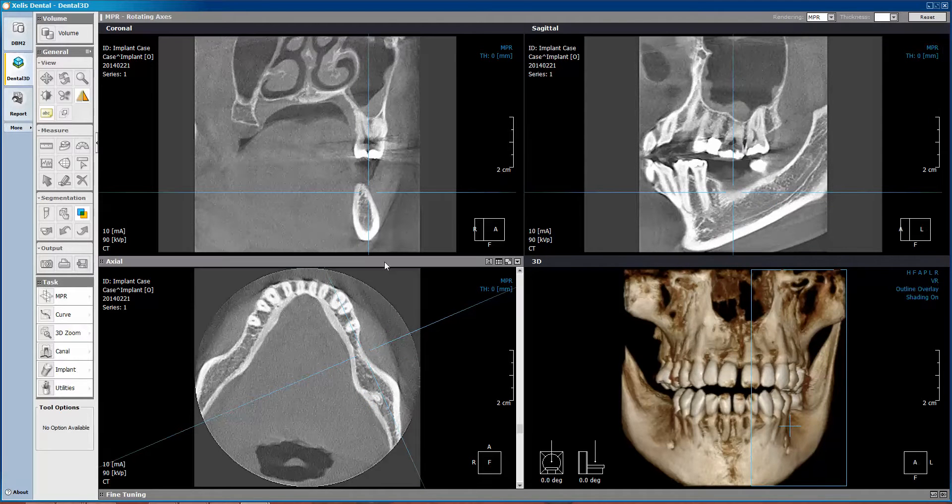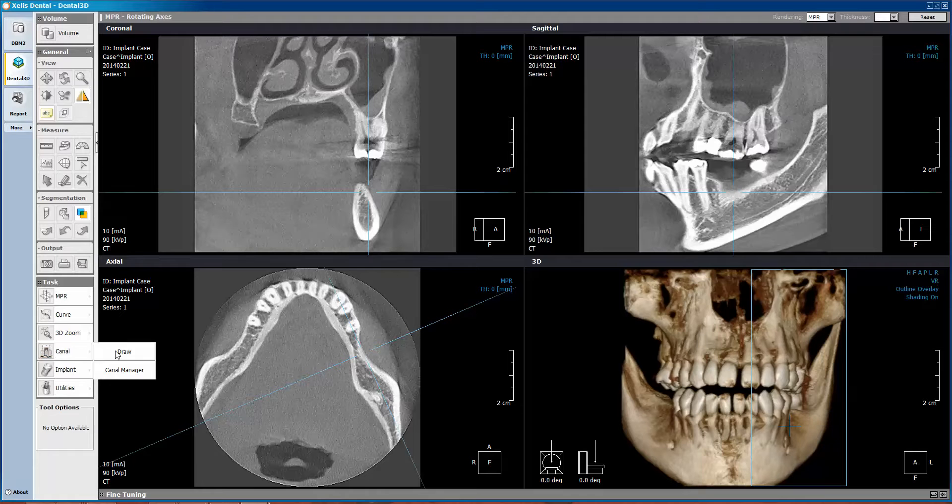We'll then move to the left of the screen. Within the Canal menu, click the arrow and choose Draw.